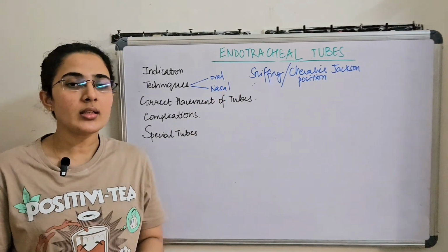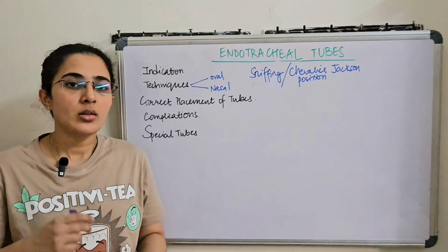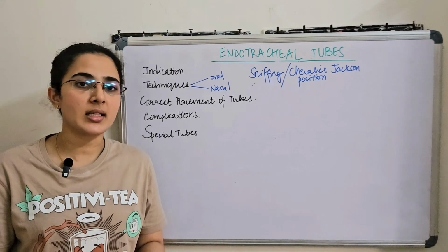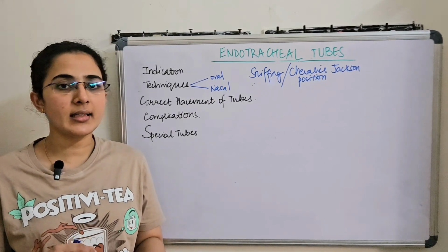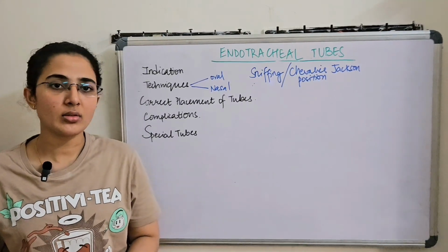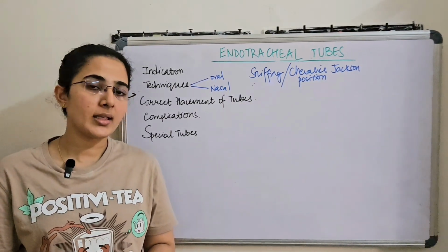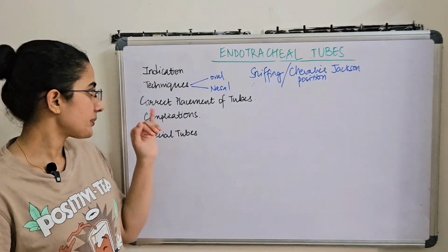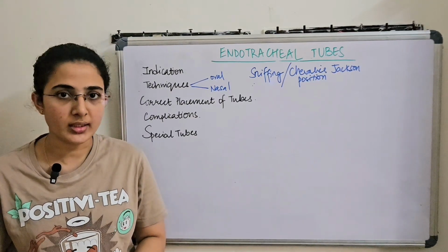Nasal intubation can usually be done where we position the patient with full extension, lubricate the passage well, and pass the nasal tube in a spontaneously breathing patient with adequate airway blocks, and we can give cricoid pressure to guide the endotracheal tube into the larynx. Usually, a successful intubation with such blind techniques is guided by moisture, or by the EtCO2 tracings after intubating the patient. Next, we have the technique of the correct placement of the endotracheal tubes.